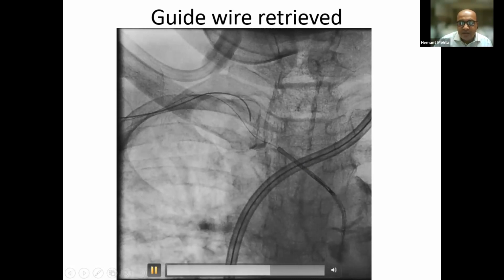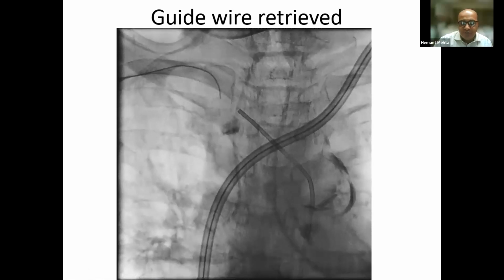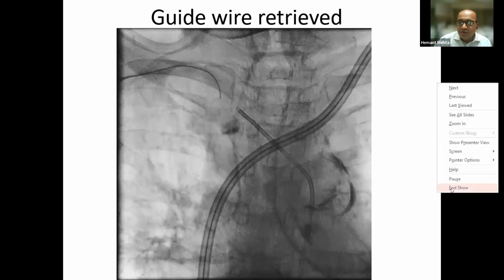So see this, this wire is coming. Now you can just pull out the catheter, and the wire will come out with it. So great, wonderful. Good.